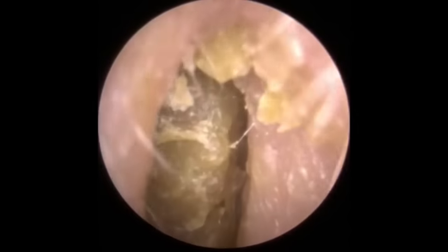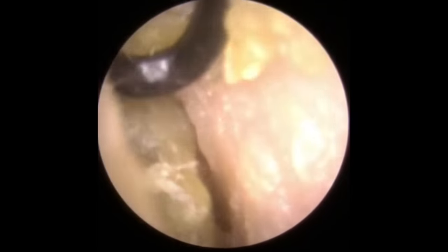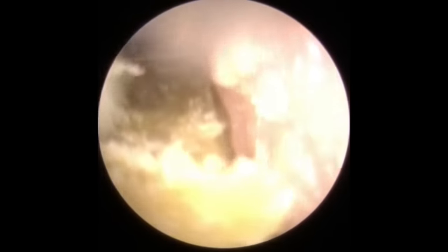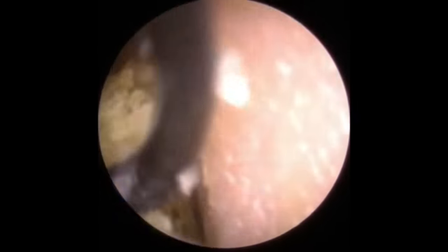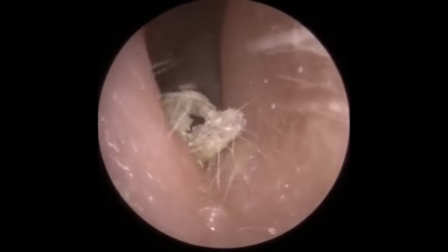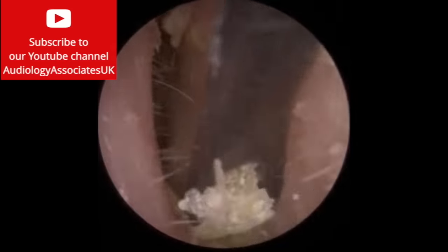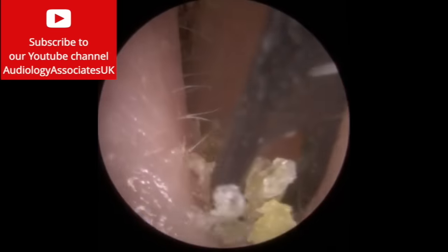What you can see is that we've got some really tough hard wax. This lady has never had her ears cleaned out before. We've tried using the standard size Zolnir 2 but it's just not getting a grip on this wax. You can see there's lots of dry flaky bits of skin around the outer entrance to the canal, which shows me that this lady does suffer a little bit with dry skin. So there's probably not a great deal of oil being produced in this ear canal, which can then effectively dry out the wax so you get a very dry and hardened wax.